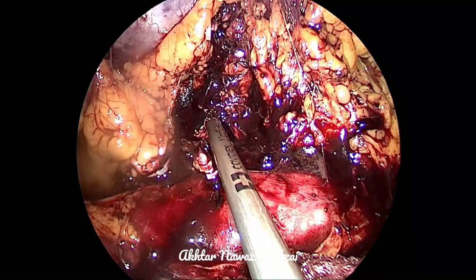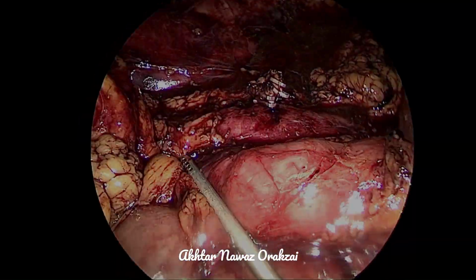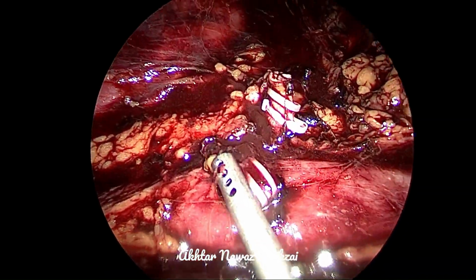And then we divide this artery, and then the rest of the procedure is done as a routine removal of the kidney. After removal of the kidney and cleaning of the cavity, you can see the pedicle nicely.